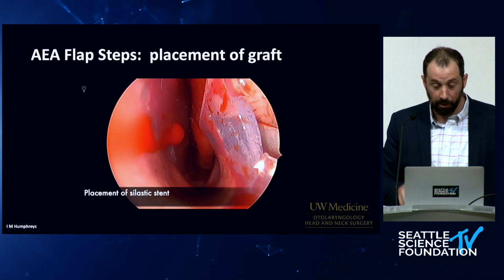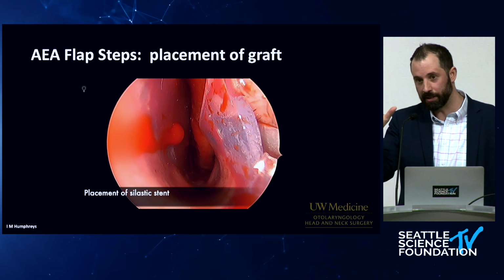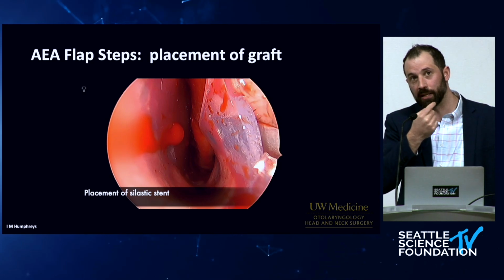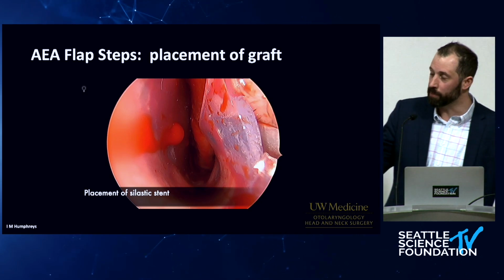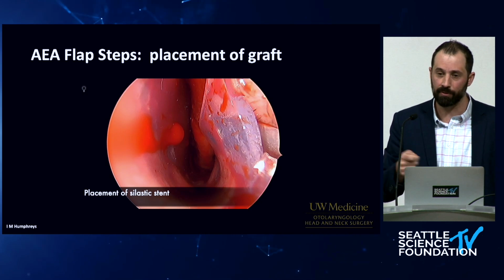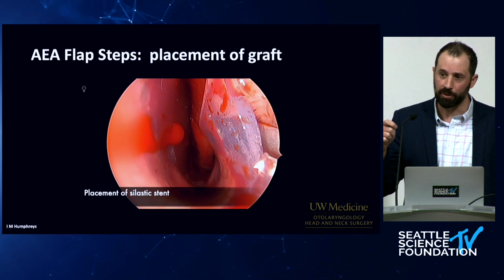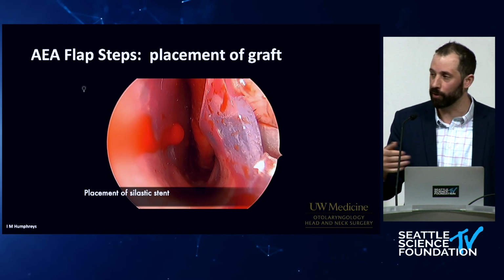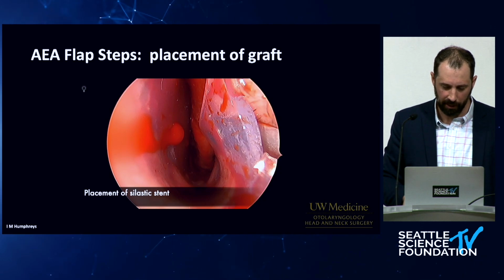So let's, in terms of suturing the flap itself to the anterior landing spot. So you mobilized your flap, it's now coming out to the anterior nasal cavity, much like if you're closing a hemitransfixion incision, whatever your preferred suture method is in that area. For me, it's a 4-0 plain gut on a Keith needle. It works really well in my hands to close that type of flat position in that area. Others will use curved needles or different types of sutures or PDS sutures in that area, whatever you prefer. I like the plain gut suture, not fast, but plain gut in that area works, I think, really well.